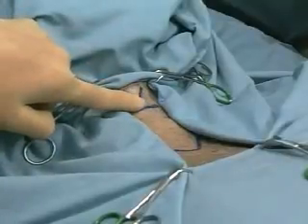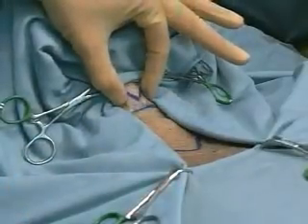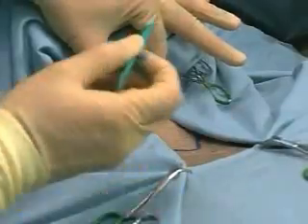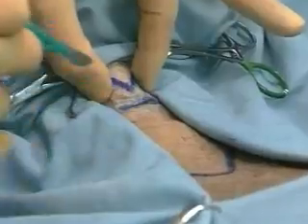Palpate the cricothyroid membrane below the thyroid cartilage in the midline. Stabilize the thyroid cartilage firmly with one hand and make a transverse incision approximately 2 centimeters in length down to and through the cricothyroid membrane.